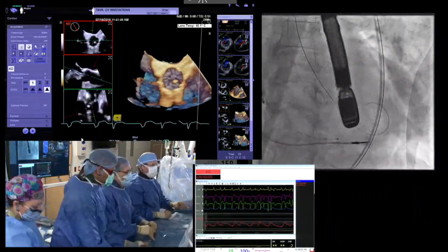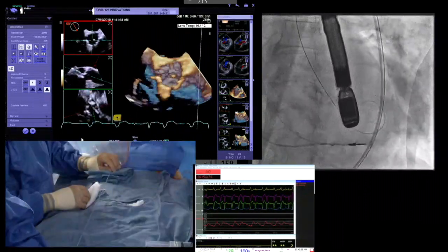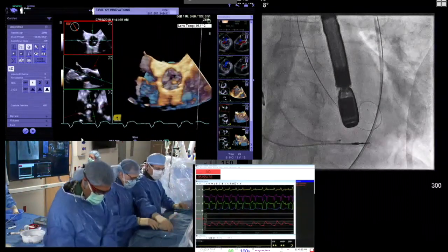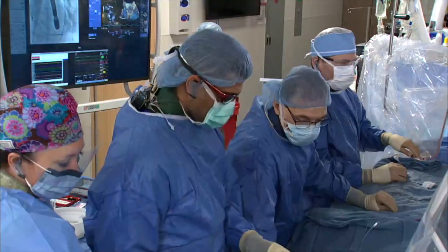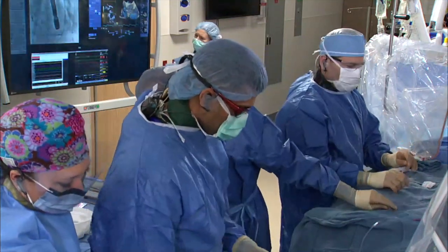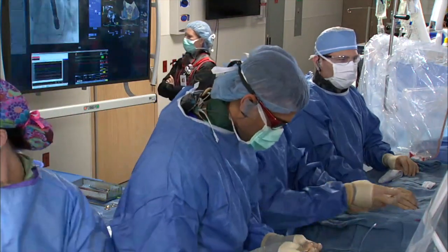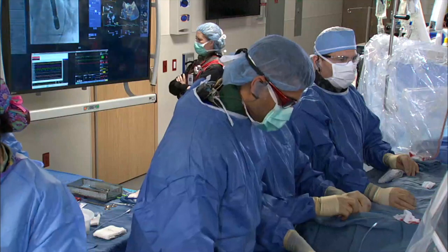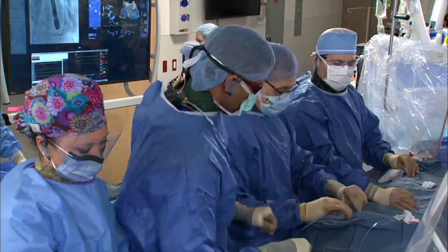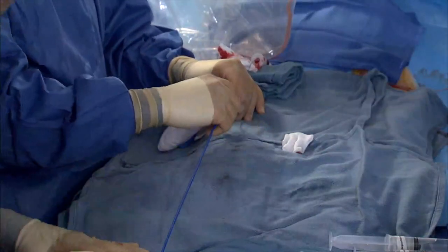Great. So I think that Dave is just getting ready to put the Safari wire in there. Molly, you want to comment a little bit about the wire, why use the Safari, and what's the strategy with the wire? Because it's different than with a core valve. So for these pre-shaped wires, they're probably safer than not having a pre-shaped wire. And for this valve, again, the capsule sits very close to the apex of the left ventricle, so you really want the capsule to be kind of wrapped up on the circular part of the Safari wire.